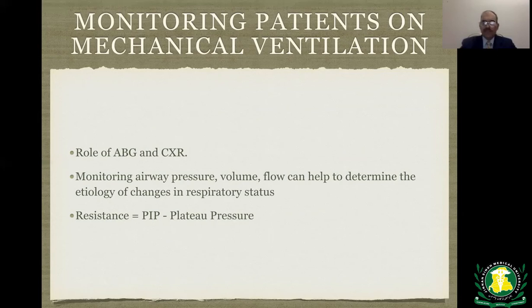an initial ABG to see your vent setting if you want to make any change, and a chest X-ray to confirm your ET tube placement. After this, do you need to do chest X-ray every day? Personally, I do not, especially for pneumonia or for ARDS. But if the patient has fluid overload, I might do it more frequently to see my response to diuresis.